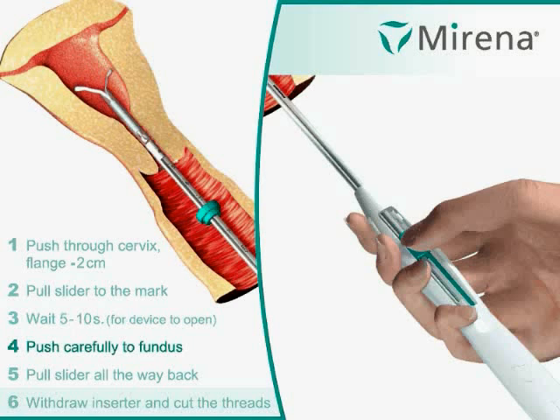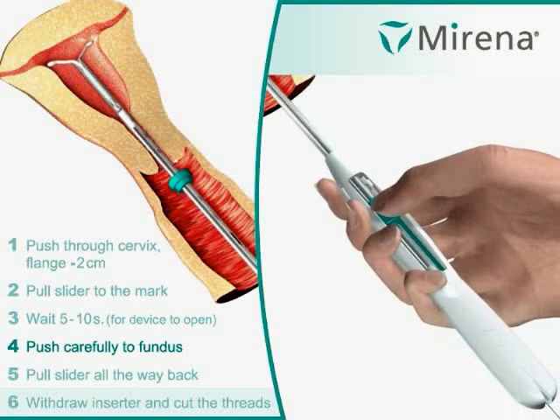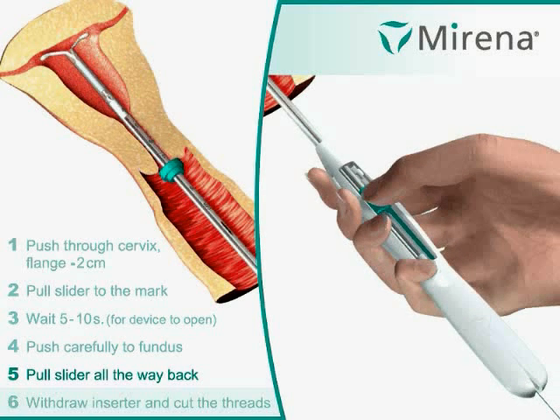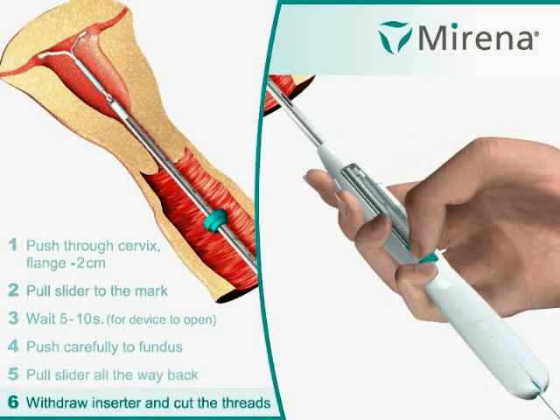Step 4: Push carefully to the fundus. Step 5: Pull the slider all the way back. Step 6: Withdraw the inserter and cut the threads.